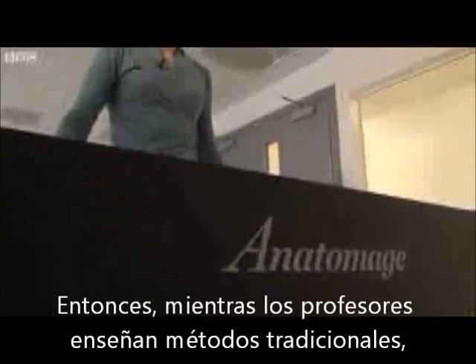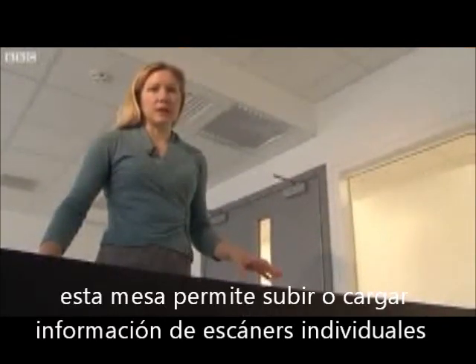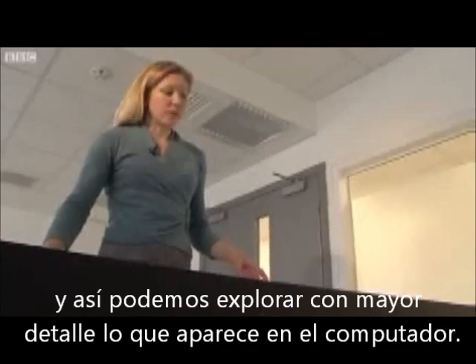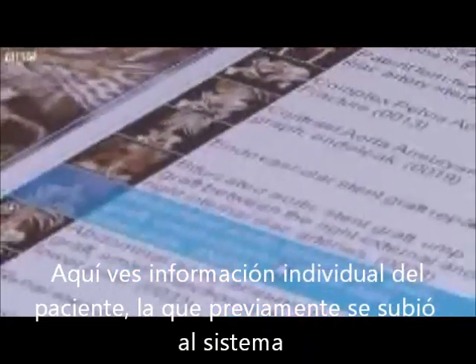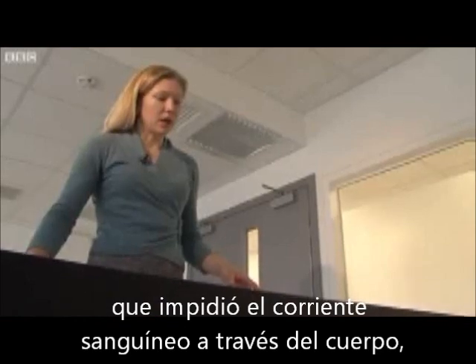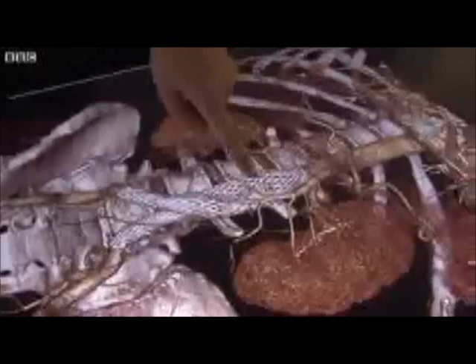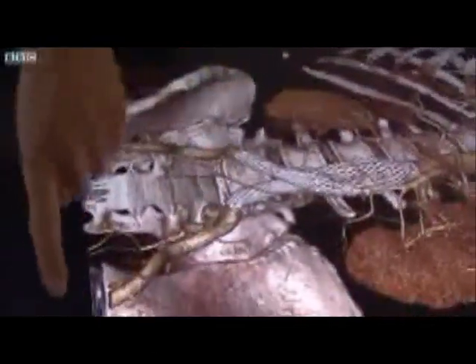So as well as teaching and learning anatomy, this table allows us to load up the individual CT data from patients, perhaps while planning an operation, and explore that so that we can plan their operation in a bit more detail. You can see here I've got this CT data of an individual patient loaded up. This patient had actually suffered with an abdominal aortic aneurysm. That's a swelling of the main blood vessel of the body, which has been treated, you can see here, with a stent graft, a tube that's been placed in via the arteries at the top of their legs.